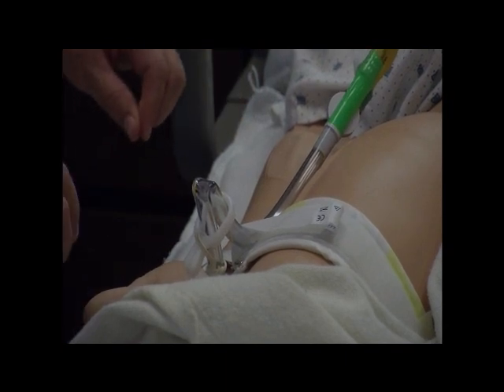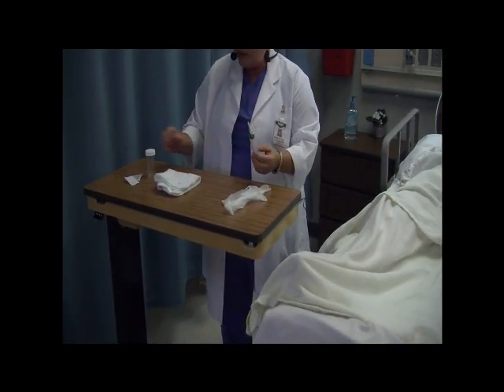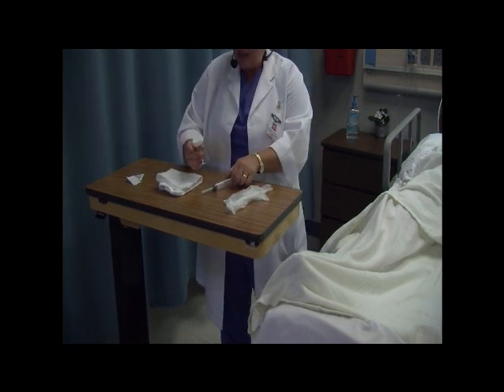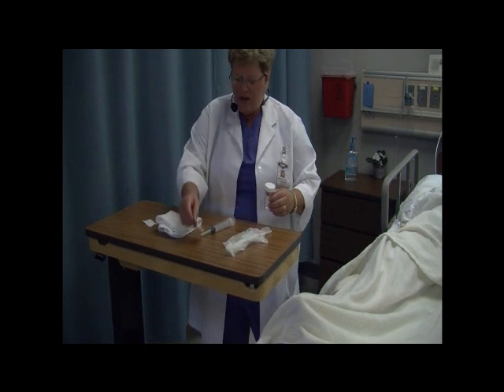While that's pooling, I'm going to go ahead and gather my supplies. For this procedure, I'll need a pair of gloves, a 10 to 20 cc syringe. I like to use an 18-gauge needle on it. I'll need a specimen cup, the label for the cup, and an alcohol wipe.